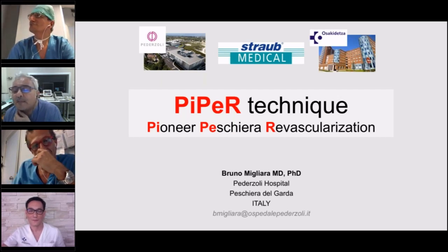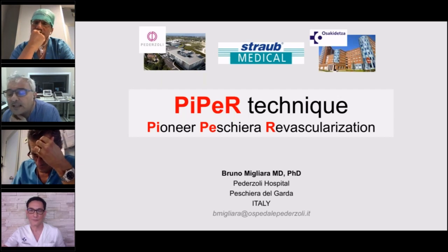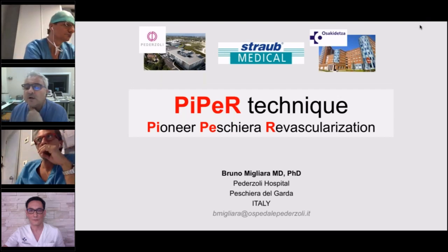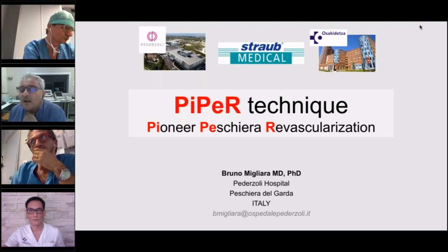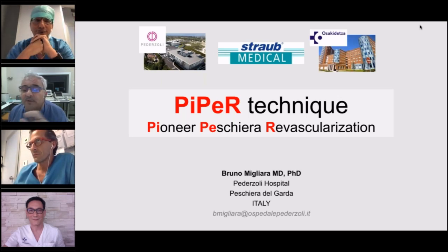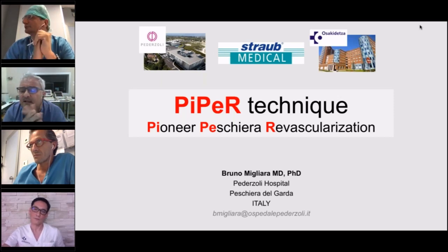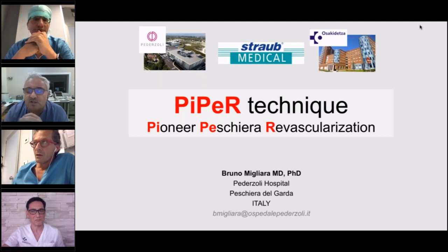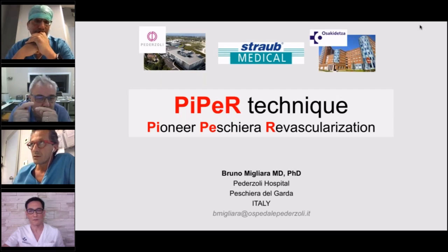Okay. There is another technical question about the overlap of stents from Giacomo Isernia, because he is telling us about leaks between the overlapped stents. So the question is, how much do we have to overlap stents in the posterior tibial vein?